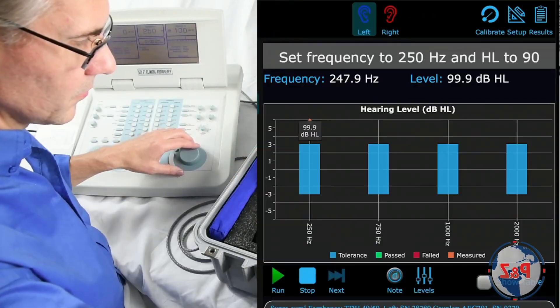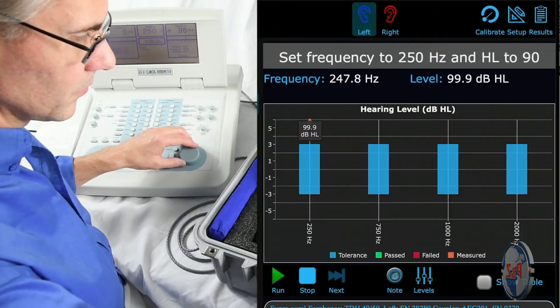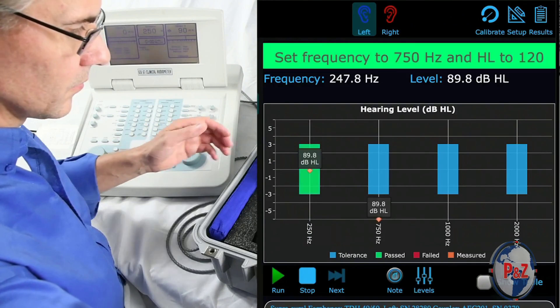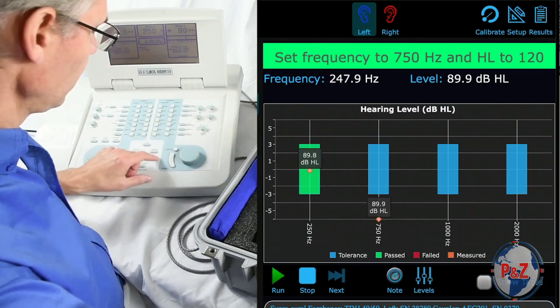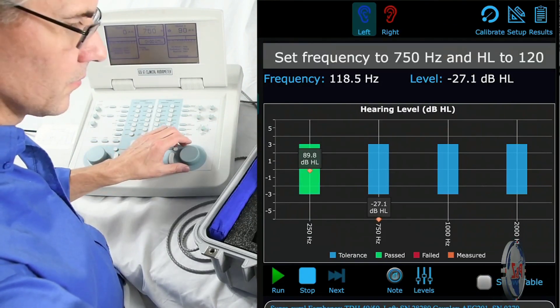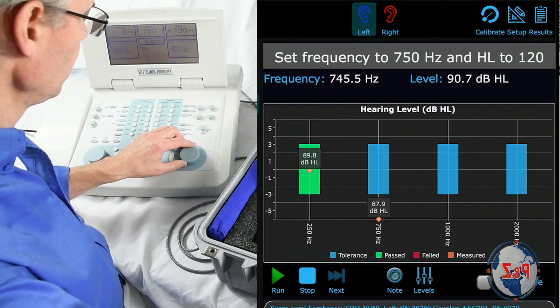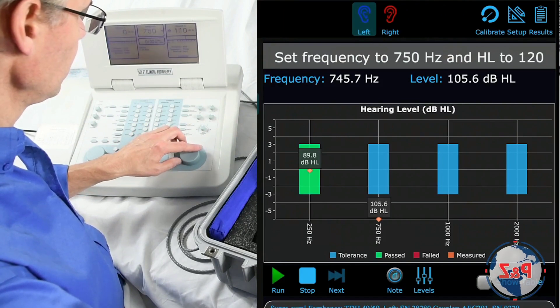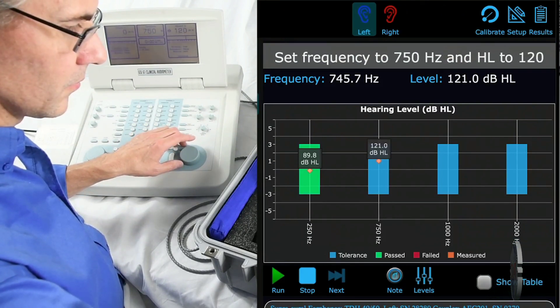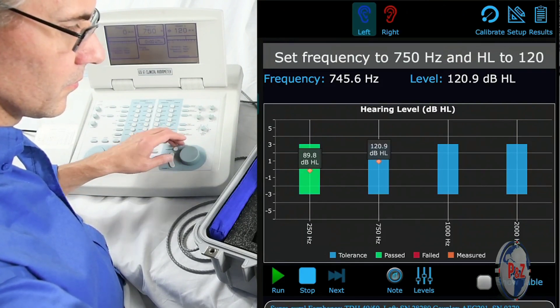As soon as one step is passed, you can change to the next step. As you can see, Brent doesn't need to wait very long to turn the dial or set the dB HL. He can keep his hand on it and turn as each frequency passes.